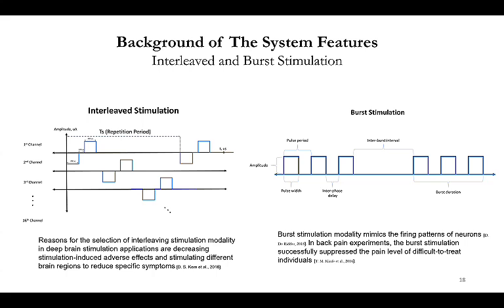The other technique is burst stimulation. In burst stimulation, there is a certain stimulation period, but there is some pause, called an interburst interval. Basically, in burst stimulation, we mimic the firing rates of neurons. This is also commonly used for pain management.